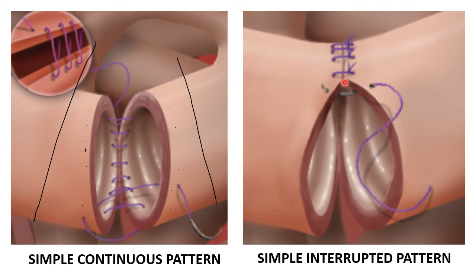You're just creating a lot of holes, and actually, most of the time, the leakage doesn't come from the incision line. It comes from the holes that you did from the suture. So be very careful, and I know you will choose the pattern that you think is best.